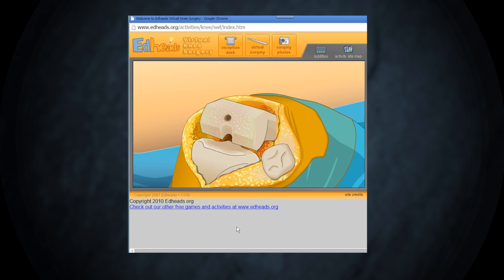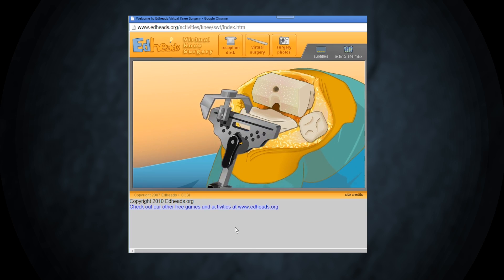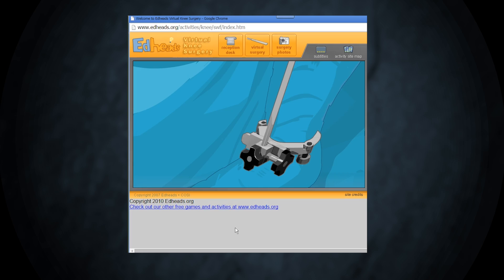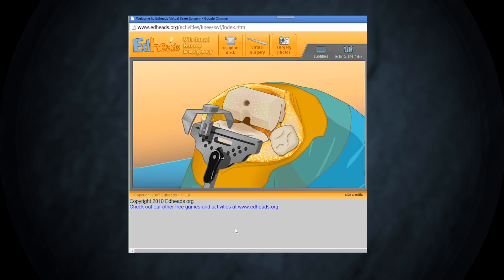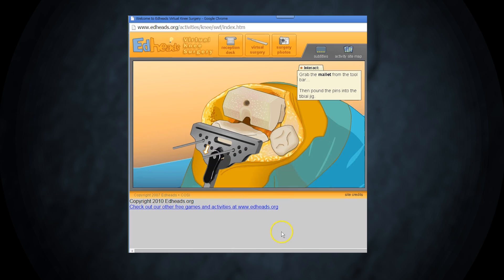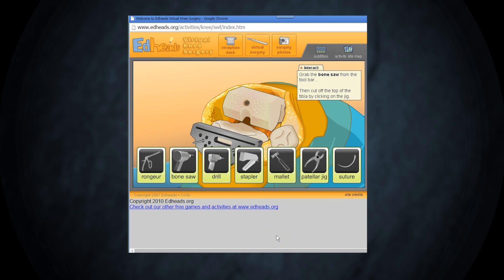Let's move on and shape the tibia. The tibial cutting jig is aligned with the big toe and the highest point of the tibia. This will ensure the leg is properly aligned after surgery. Secure the jig in place with more pins. Use the bone saw to cut off the top of the tibia and prepare it for the new tibial components.